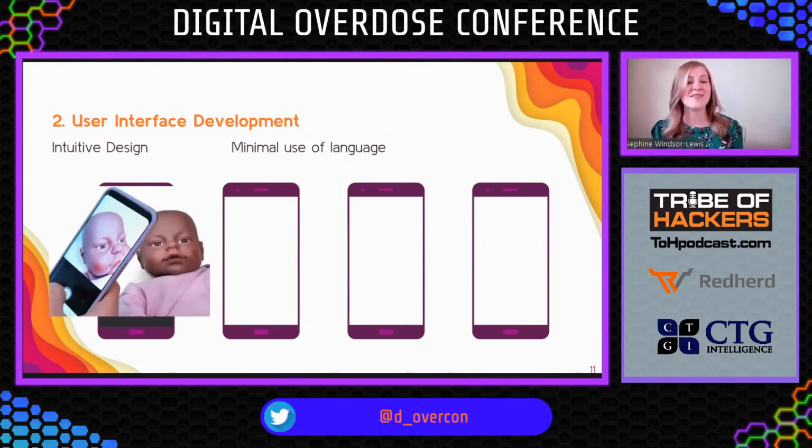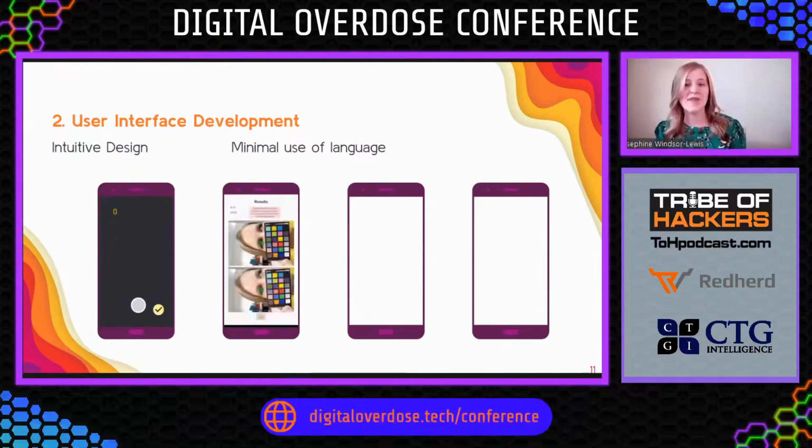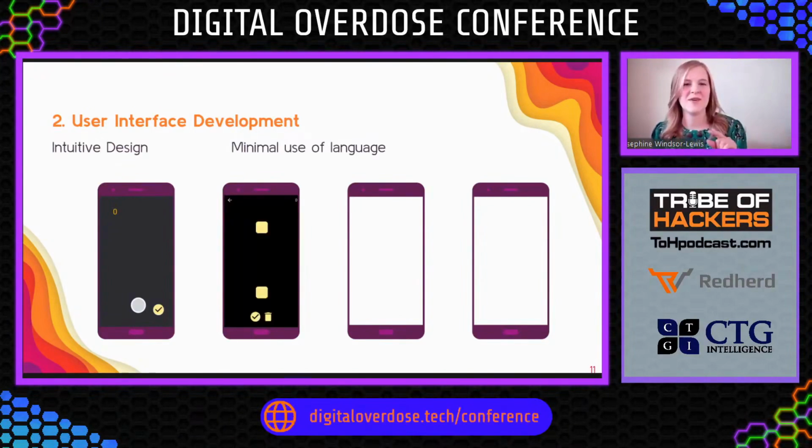This is what it looks like. That's not a real baby, but it is how the app would work in real life. After that, you're shown this screen. Now this can look a little confusing, so I'll walk you through it. What you're seeing here is actually two images, one on top of the other, kind of looks like that in real life. And a square in the middle is clearer on the screen.